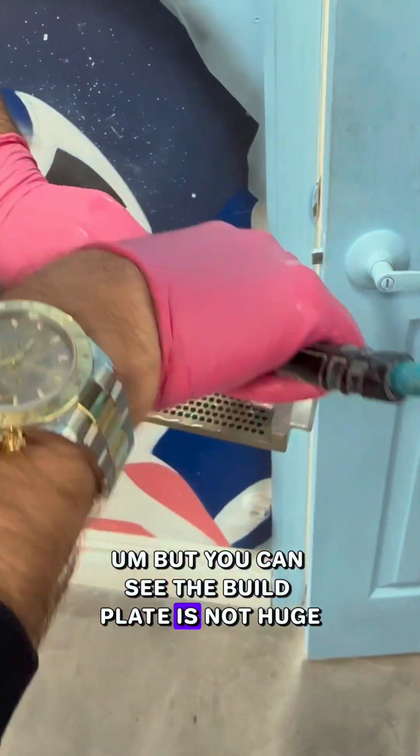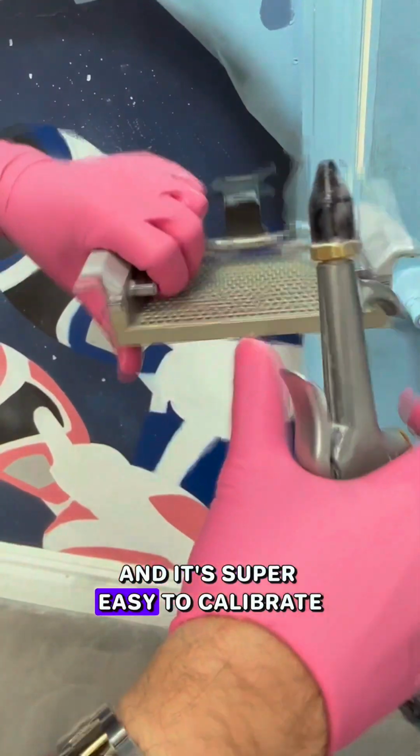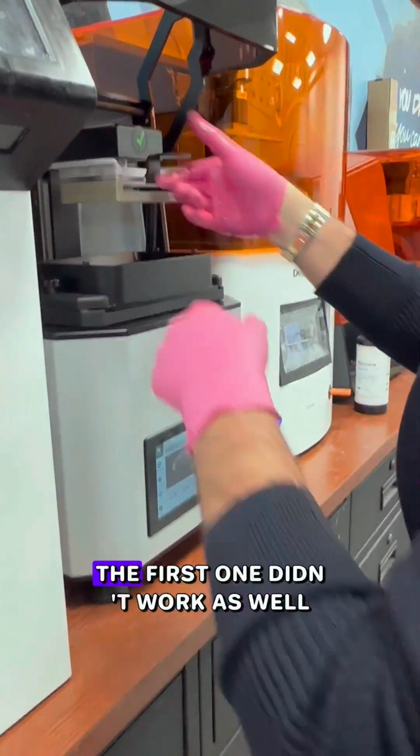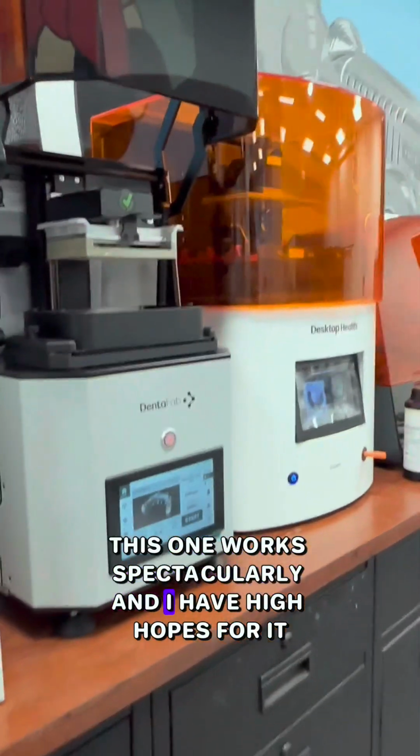But you can see the build plate is not huge, but it's good for hybrids and same day dentistry, and it's super easy to calibrate, which is great. I love this printer. If it works, the first one didn't work as well. This one works spectacularly, and I have high hopes for it.